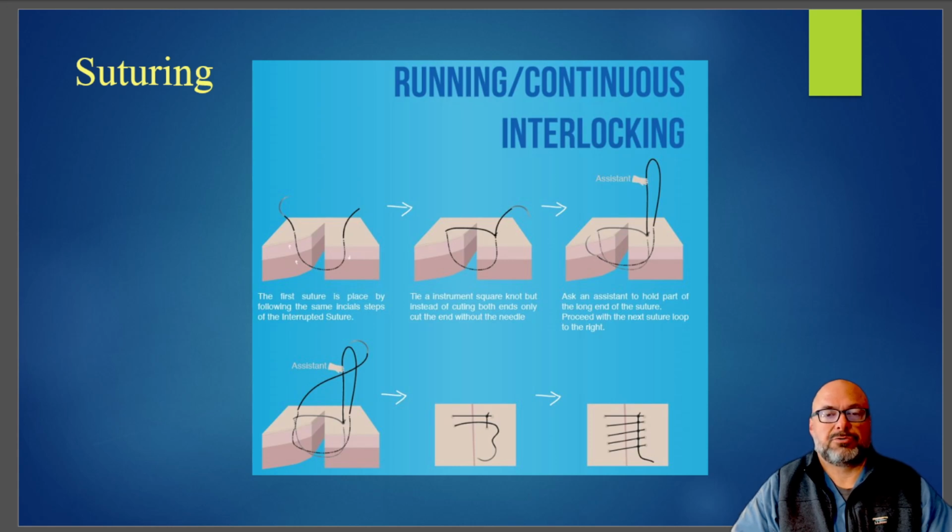All right, so we talked about running continuous sutures. We tend to use those on tissue that needs to be reapproximated, but that's relatively hemostatic. So we tend to use it if somebody's closing the peritoneum, which you won't see much, but closing the fascia, closing the subcutaneous space, people tend to use a running suture for that. So you get good tissue reapproximation.